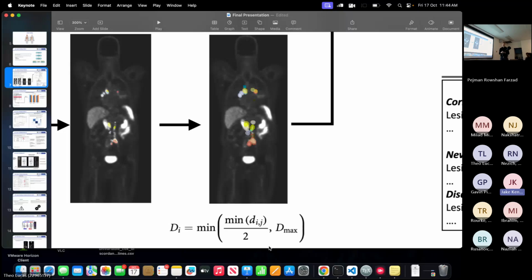I know, but sometimes it might happen. The data I was working with was most likely 100% prostate cancer lesions, because it is a fact that when they're really aggressive, the prostate tumours will tend to uptake FDG.